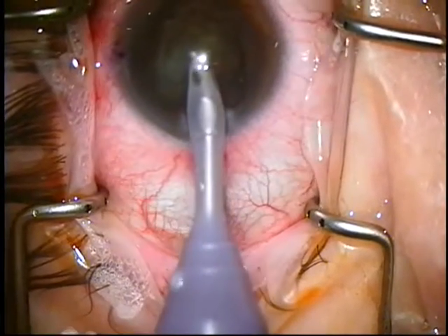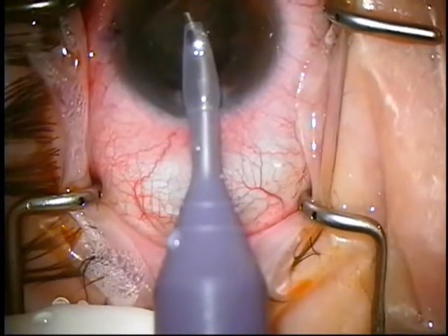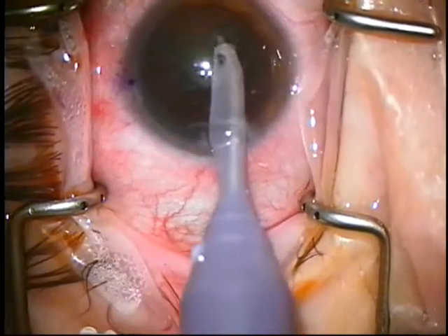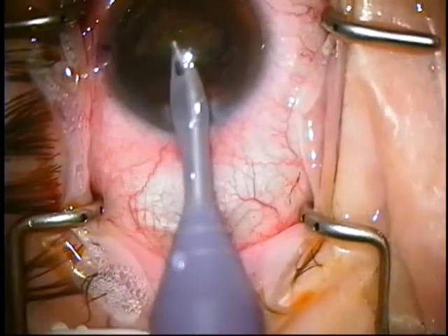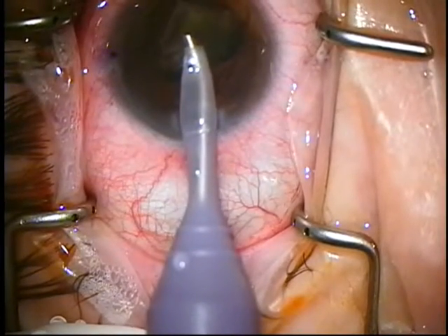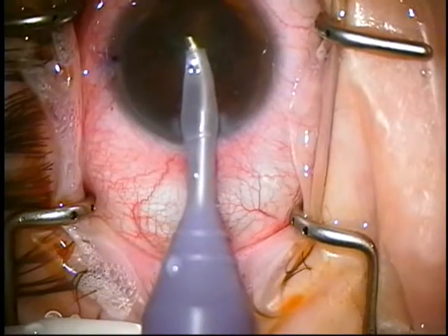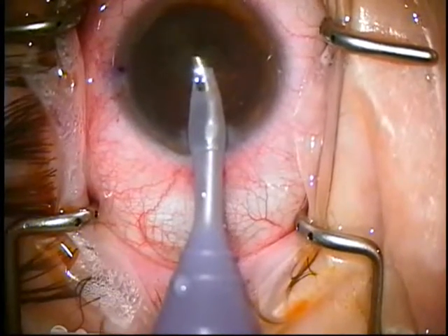You work at keeping your hand not moving. When I'm here, my hand is not moving — it's not following. I'm putting this piece back where it belongs, because it's easier to grab if I do it like this. I bring it up and let my handpiece remain nice and still. I let the nucleus come to me. Don't go after it — that's how you slightly bend down and get posterior capsule.